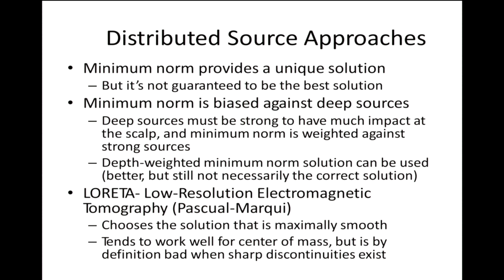Similar to fMRI data, where you get the voxel intensity and you know exactly where this individual voxel is located. The only difference is that in fMRI each voxel can be as small as a millimeter cube. I think LORETA is around 10 or 15 millimeter cube, so it's much larger. But what you get is a similar idea: distributed sources, and for each you know where exactly it is located.